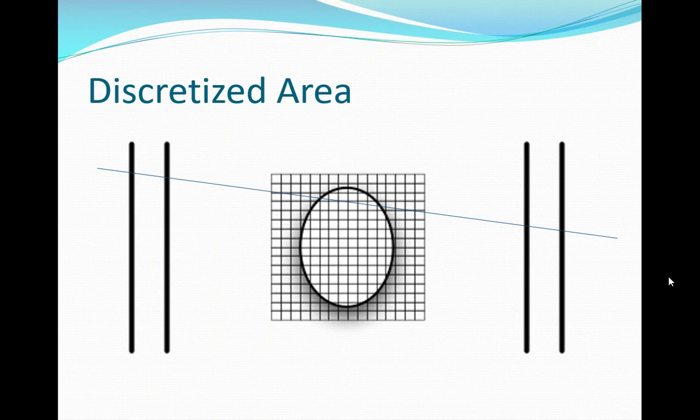But anyway, we take the area and we discretize it. We chop it up into little blocks called voxels. This is just one slice of it, and you have an individual proton passing through. In this case, I'm not showing the deflection, but you can see it travels through certain voxels. We mark those voxels, the ones that it's going to hit. So this is how we want to set it up. And then over here, it's going to detect, here's my particle, and away I go. Okay.